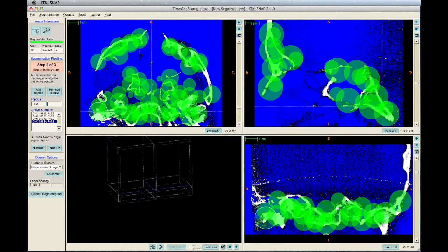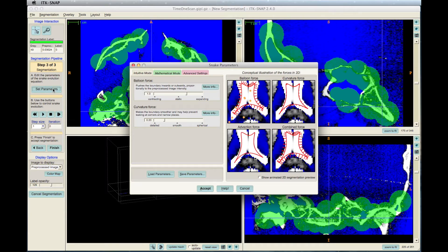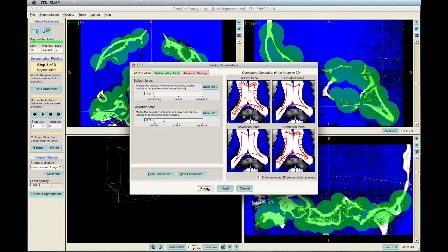Click Next when you've completed the bubbles. The next step is bubble shaping. First, click Set Parameters. In the window that pops up, modify the red lines in order to keep them inside the white.